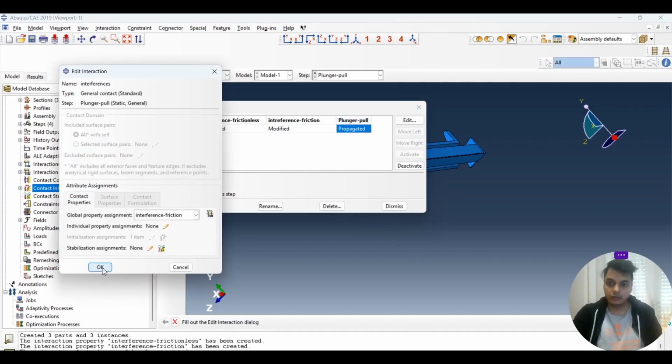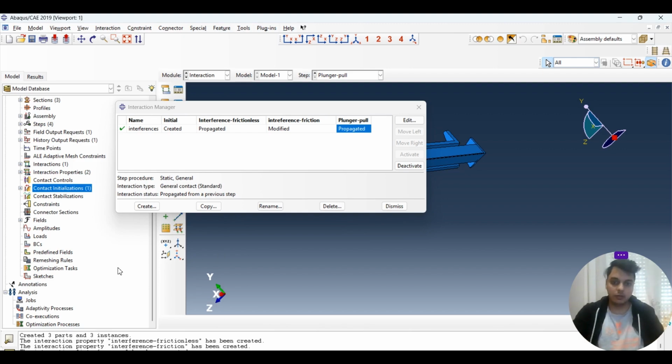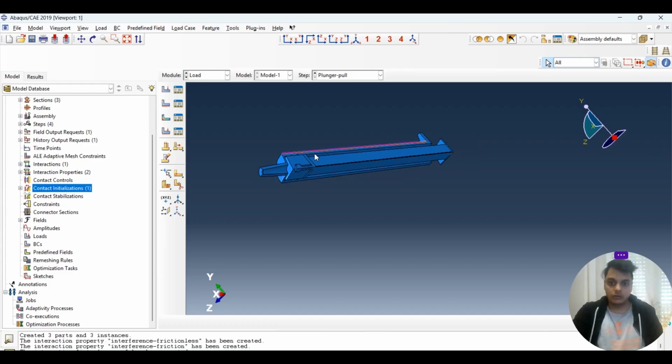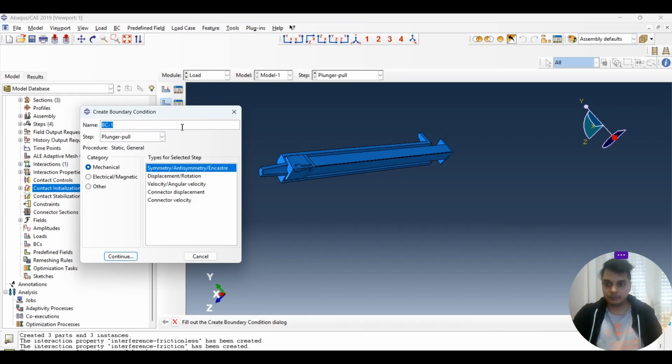So if you see again, the friction is added once we are pulling the syringe. So yeah, that's good enough for us. And now interaction is all defined here. We have to define the load. Since we are only working with the displacement boundary condition, that's what we will define here. So we want to define, let's say, initial boundary condition.